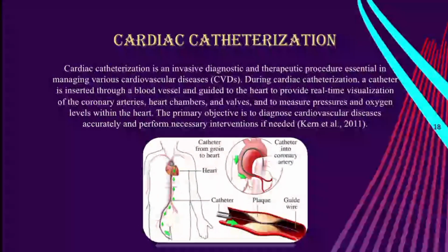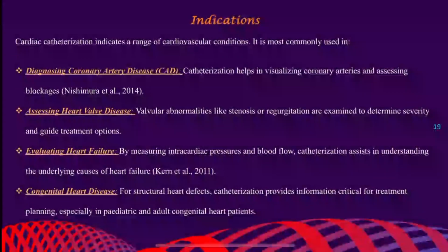Cardiac catheterization. Cardiac catheterization is an invasive diagnostic and therapeutic procedure essential in managing various cardiovascular diseases. During cardiac catheterization, a catheter is inserted through a blood vessel and guided to the heart to provide real-time visualization of the coronary arteries, heart chambers and valves, and to measure pressures and oxygen levels within the heart. The primary objective is to diagnose cardiovascular diseases accurately and perform necessary interventions if needed.